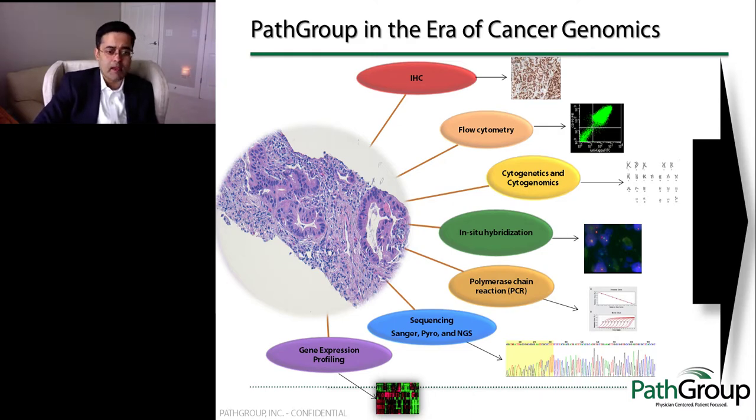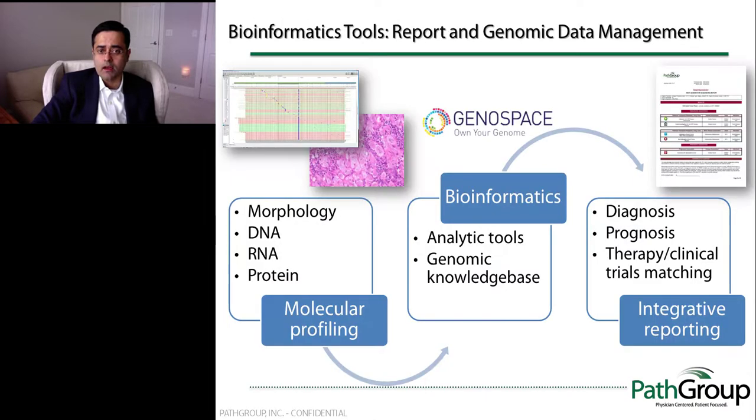And this is an example that I show here of an invasive lung cancer in a patient with advanced stage disease, where it's standard of care to work a tumor up with a thoughtfully selected immunohistochemistry panel. And then, it's important, according to NCCN guidelines, to look at alterations in genes, including EGFR, ALK, ROS1, BRAF. Again, invasive non-small cell lung cancer. Again, if this is a widely metastatic non-small cell lung cancer, you might want to cast a broader net. So again, just wanted to highlight the workflow, how diagnosis is rendered, how it leads to downstream decision-making and test utilization.